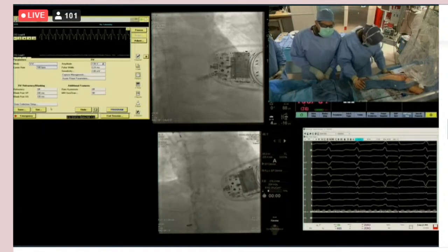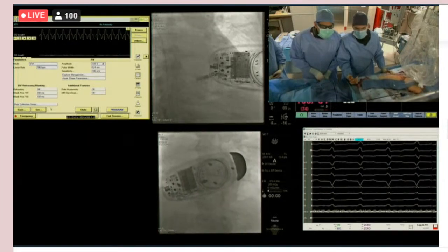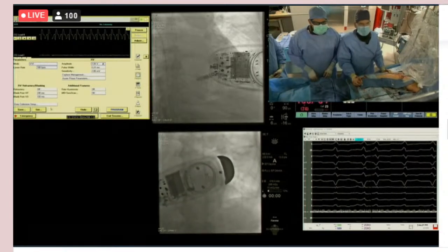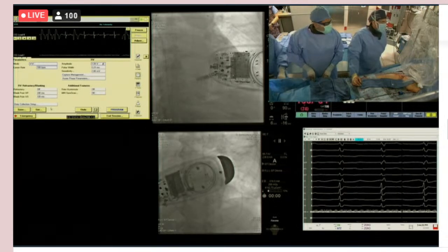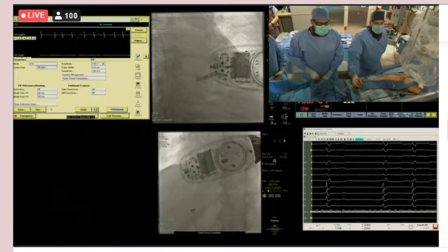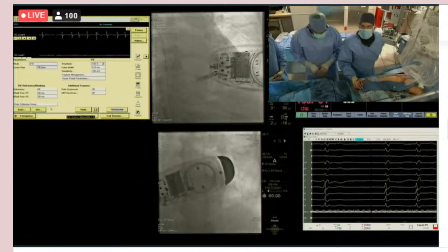It does look different, yeah. So down at 4. 375. 625. Loss right there. 3.38 and 0.24. Well, the impedance is a little bit on the high side. So your threshold is what, and your impedance high is right now? It's 3.5. The threshold.